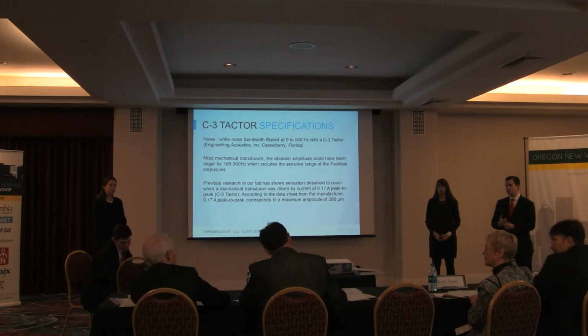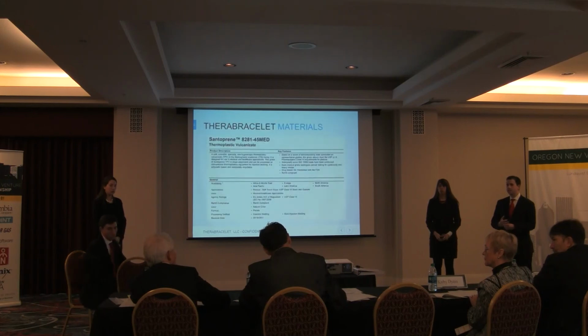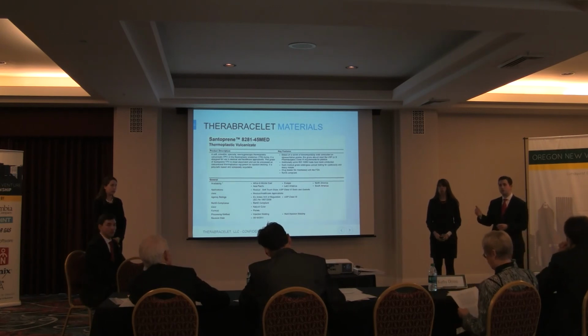Amplify on the ideally, I mean, how are you thinking this through? How will it be recharged? I know it's still a prototype phase. Sure. It has a charging port, so it utilizes a standard USB charging port.